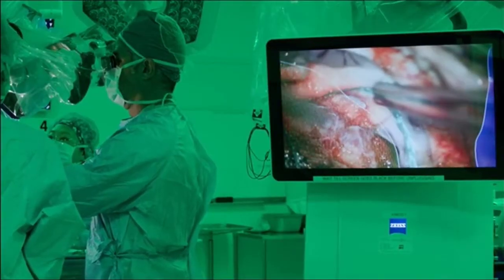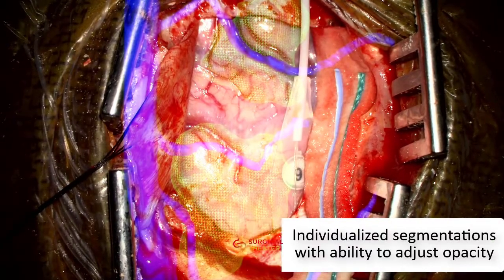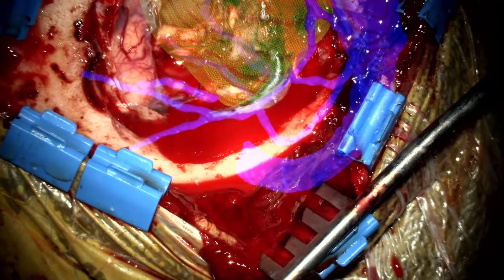Surgeons are given control to fade in or out of semi-transparent structures as needed. Tumors, tractography, arteries, veins, and other relevant structures can be viewed separately or combined.